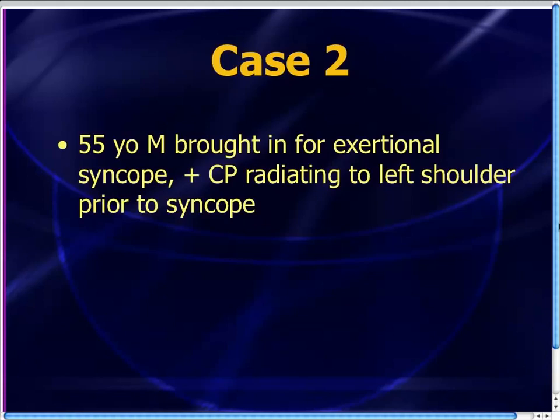And then on top of that, this guy is not really in that age range where we typically think about vasovagal. We've talked a lot in past videos about what you'll look for on the 12-lead EKG for somebody that has syncope. Most of those cases, however, were just plain old syncope. This guy actually had chest pain associated with the syncope. So my first thought is, is this acute coronary syndrome? Is this PE? Is this dissection?